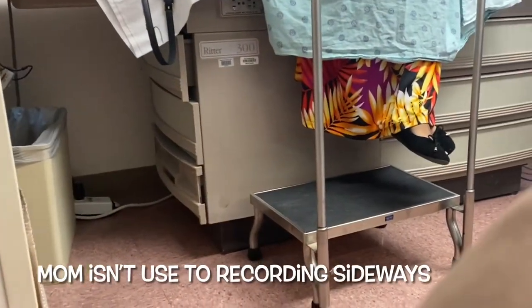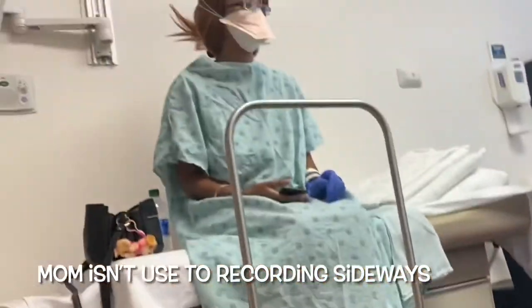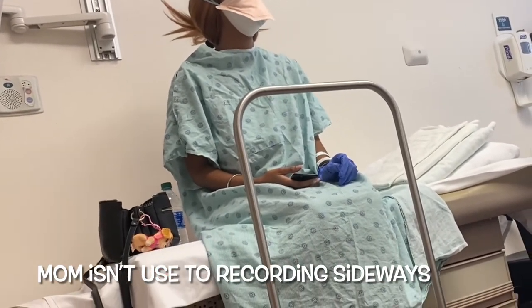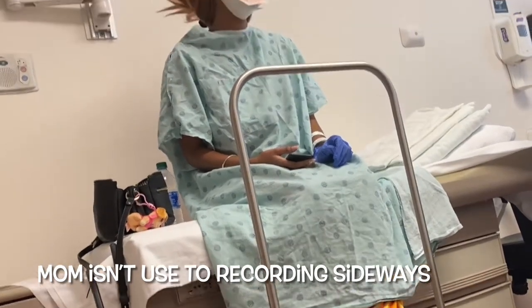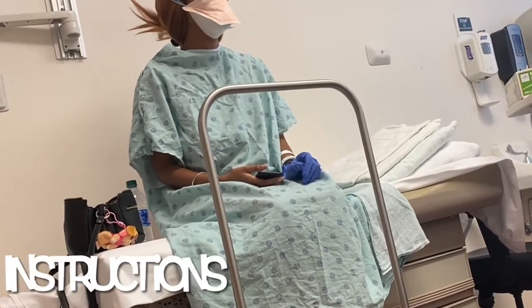So the esophageal manometry is a tube in your nose. It goes to the stomach, and the purpose is to measure the pressures in there to get the number your esophagus squeezes at. I understand it sometimes feels like things get stuck in there. And so it is uncomfortable, but since you're allergic to the medicine, we'll just have to put the tube down, okay? When the tube is in place, I'll ask you to lie down on your side.